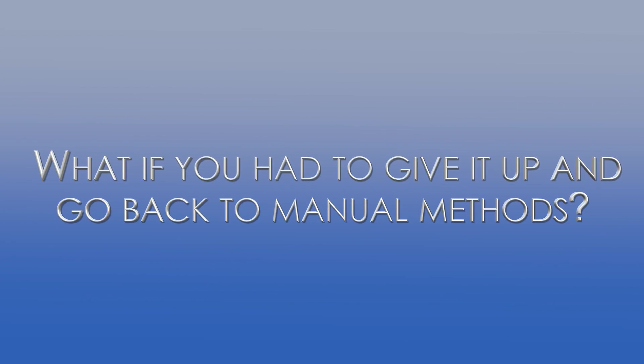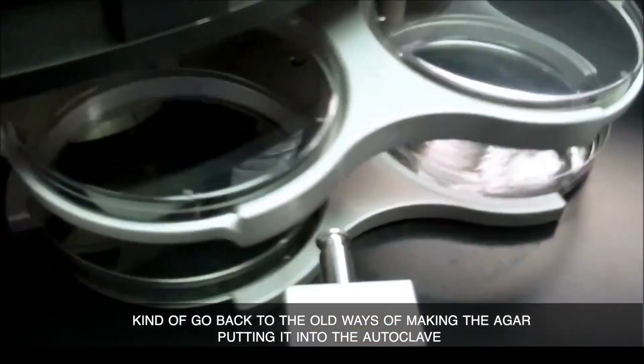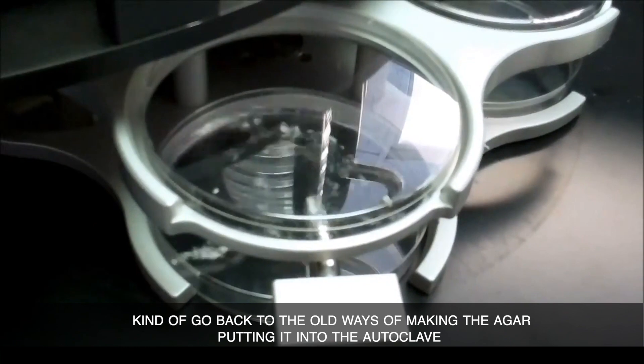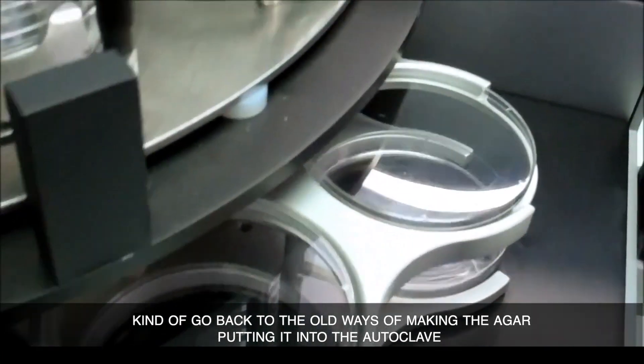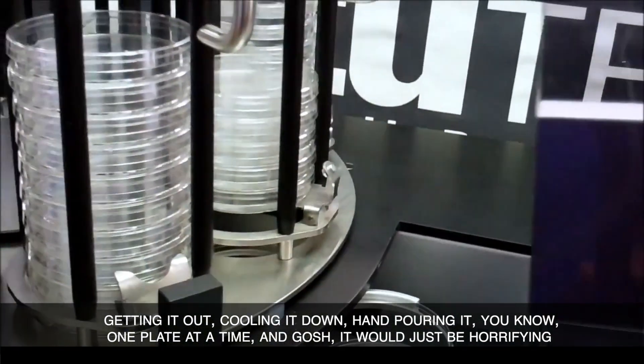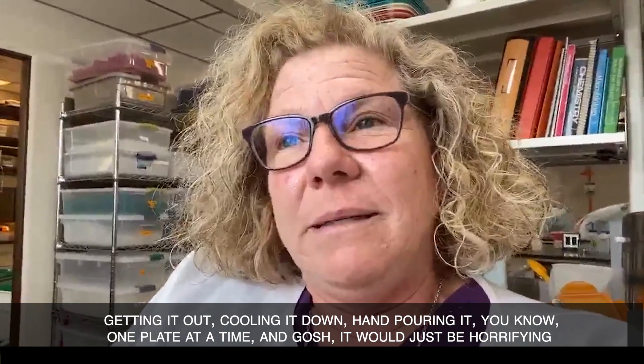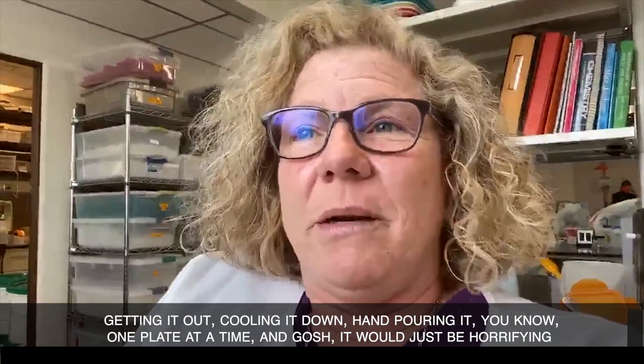I would cry if we had to go back. We would just have to adjust and go back to the old ways of making the agar, putting it into the autoclave, getting it out, cooling it down, hand-pouring it one plate at a time — it would just be horrifying.